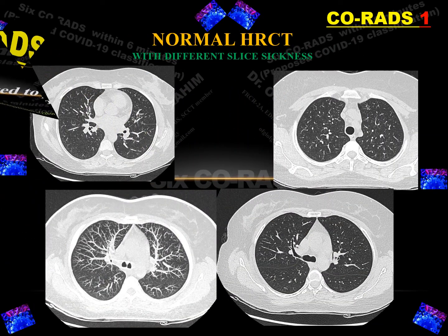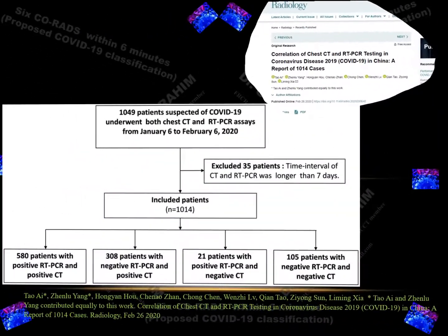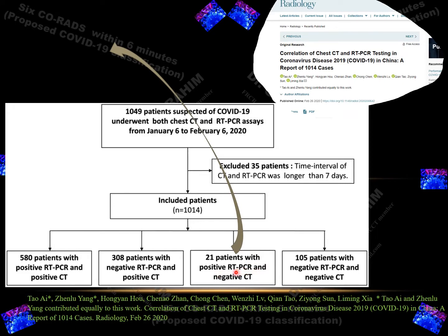As we see here, this is a normal HRCT which is considered CO-RADS 1. In a study done in Wuhan on 26 February 2020 with more than 1,000 people, 21 patients had positive RT-PCR results although they had negative CT findings — meaning normal CT. So it's classified as CO-RADS 1, highly unlikely. However, there are still possibilities for a diagnosis of COVID-19 even with this highly unlikely classification.